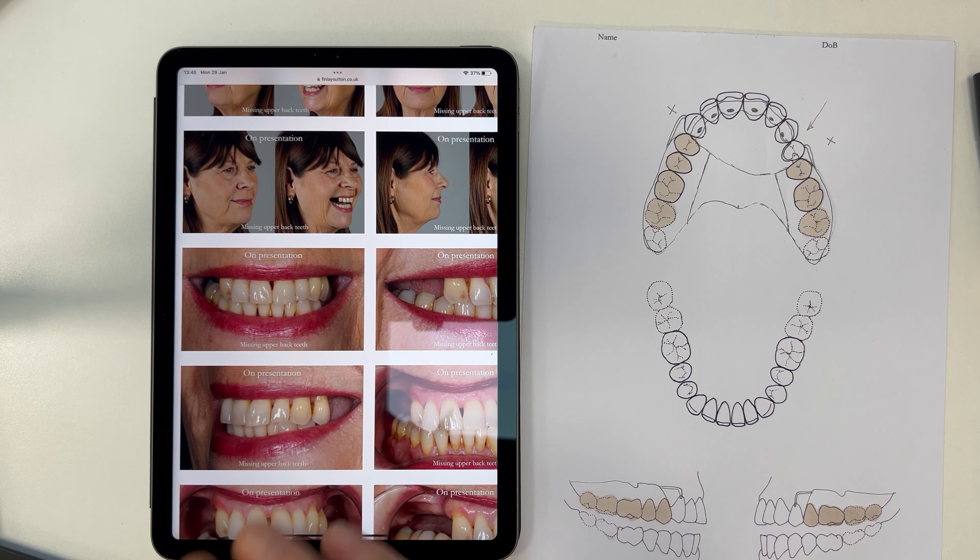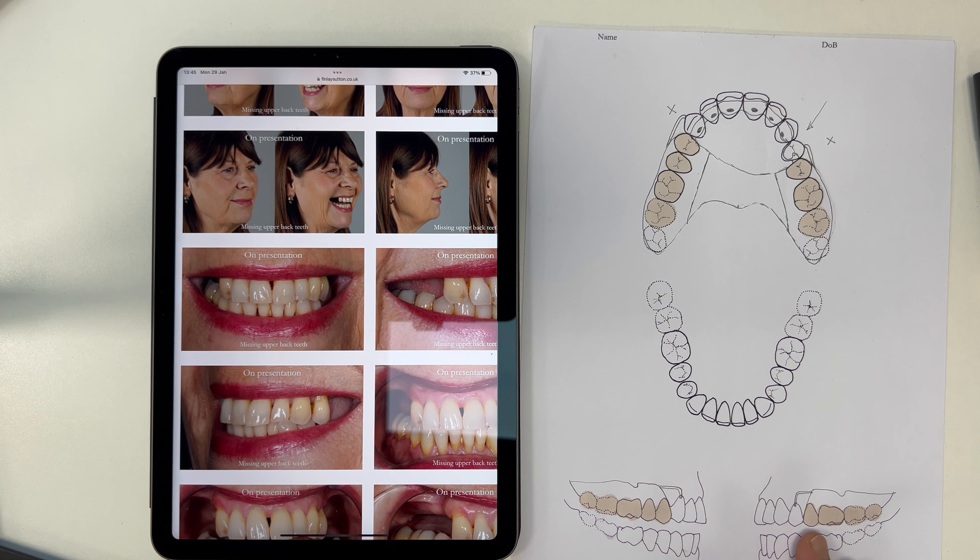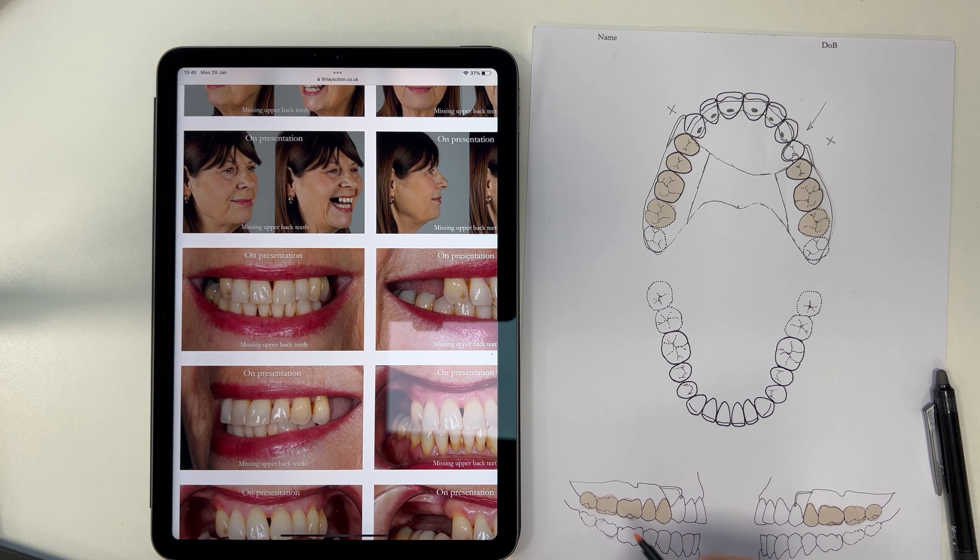If you want to see a shell clasp, just look up my newsletter which has Zephyrine on it — she's the repaired cleft lip and palate case and it's terrific, it's got a nice shell clasp that works beautifully, made of acetal resin. So let's colour everything in now — I'm going to colour in these areas here where we've got the flanges.